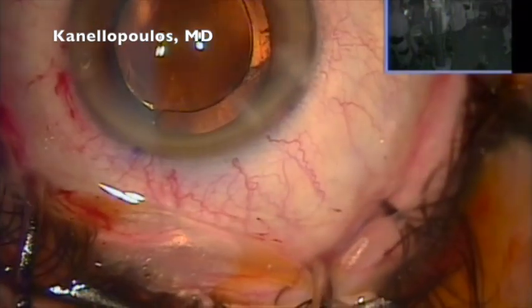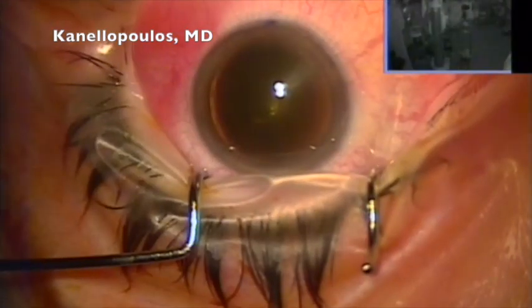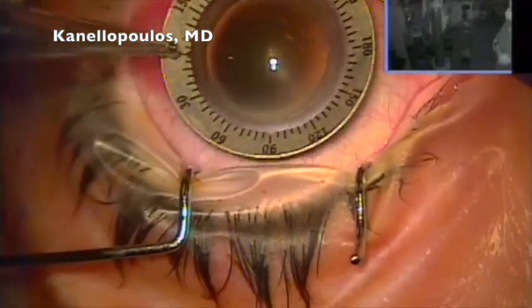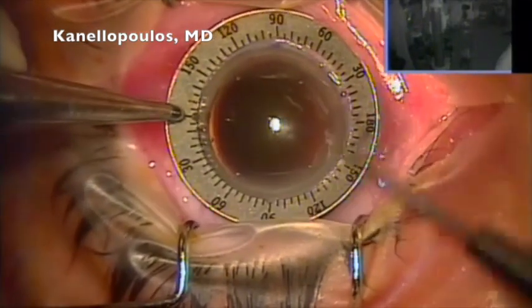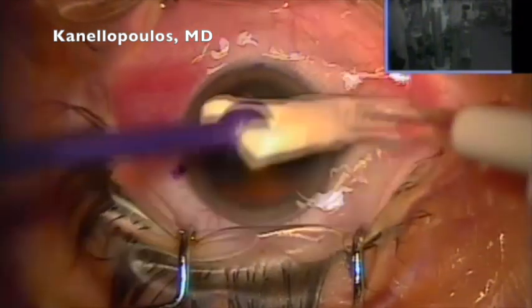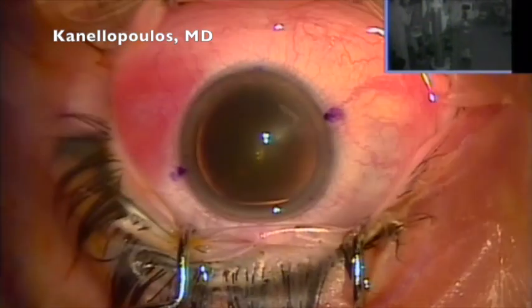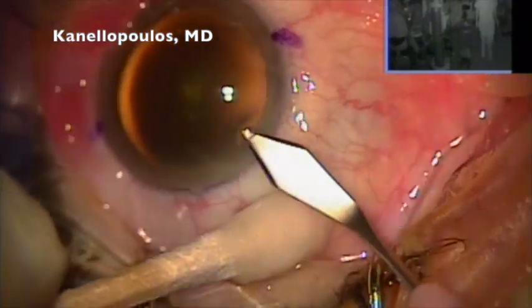We mark the 6 o'clock on the slit lamp and use it as a plane. This is now the other eye, the dominant eye. Our goal here is a minus 0.2, again with a target of plus half a diopter with the rule astigmatism. So if the patient is slightly against the rule, we'll still put a toric lens.